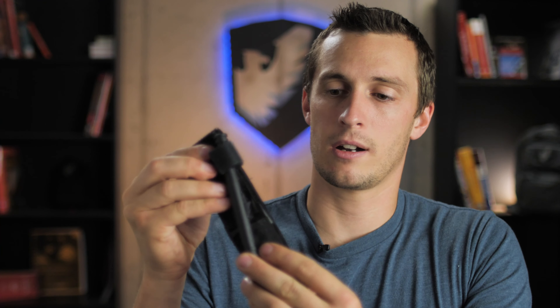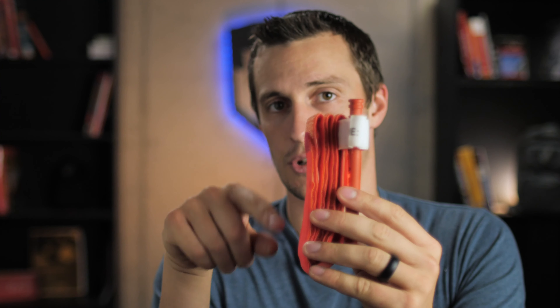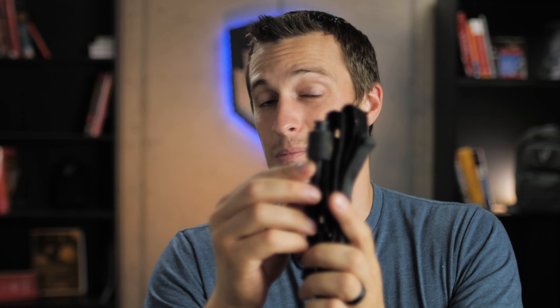Typically, you can fold it to where it's a little bit thinner but longer, or you can make it shorter, but that in turn makes it a little bit thicker because you have more material you have to fold back and forth. We have a way we want to show you that actually takes the majority of this tourniquet on the back and folds it up under the front to make it thinner.